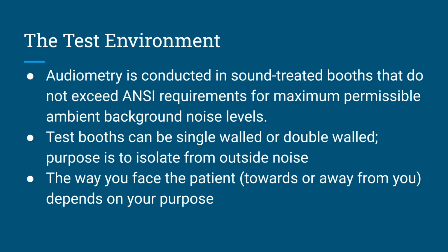The test environment. So we want to think about the environment that we're testing the patient in. Audiometry is conducted oftentimes in sound-treated booths, but not exclusively in sound-treated booths. It can be conducted in a quiet room, but sound-treated booths have been the historical norm. And there are ANSI standards that specify the maximum permissible ambient background noise levels for audiometry testing. Test booths can be either single-walled or double-walled. Double-walled is like a room within a room. The purpose is to isolate from outside noise.